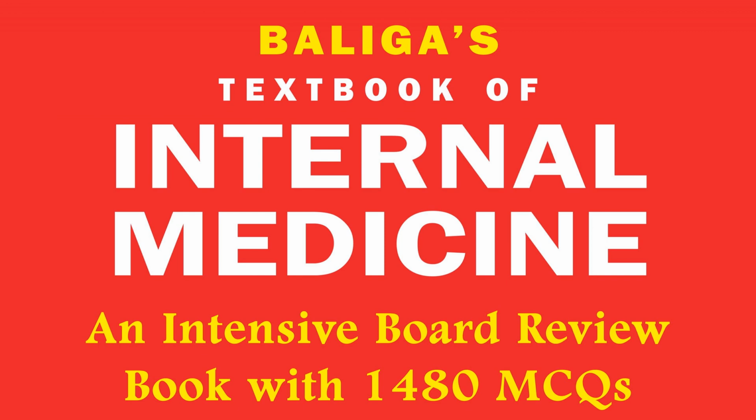the potential diagnosis. Until the understanding improves of this condition and until future research offers insights into the role of T1 mapping, T2 mapping, and calculation of ECV, they suggest that endomyocardial biopsy should be pursued when clinical suspicion remains after a normal cardiac magnetic resonance imaging. In addition, they say it's well known that T2 weighted STIR method offers limited sensitivity.